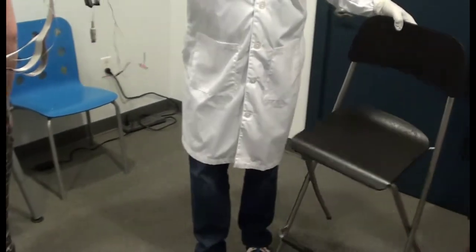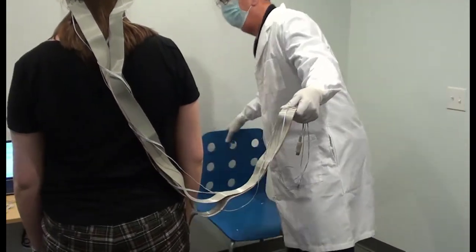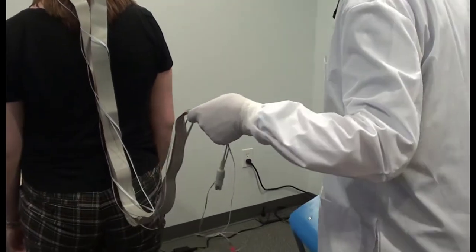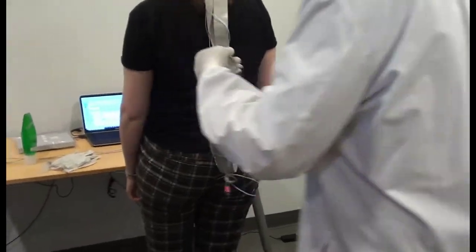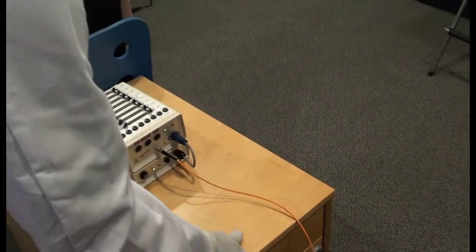After all of the electrodes have been applied and you've organized the cables, if you need to move the participant to a different chair, this is the time to do so. In this example, we used a high stool for electrode prep, but we will use a low stationary chair during the experiment. Roll the cart or cabinet holding the AD box into place behind the participant.